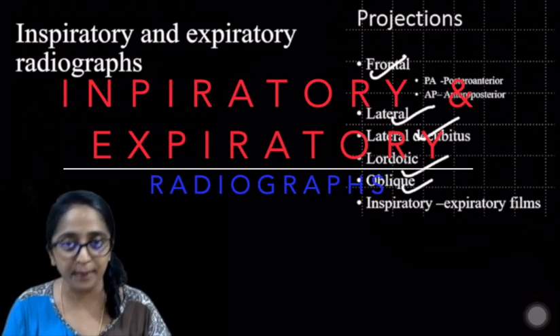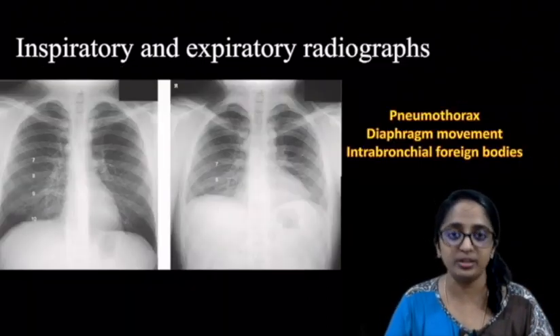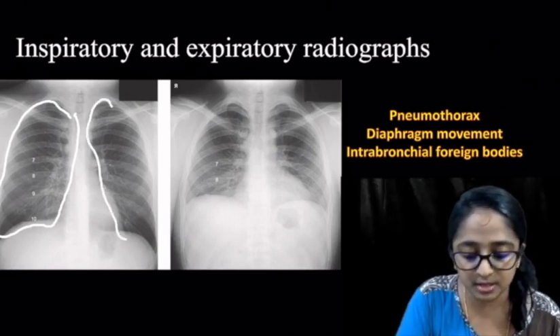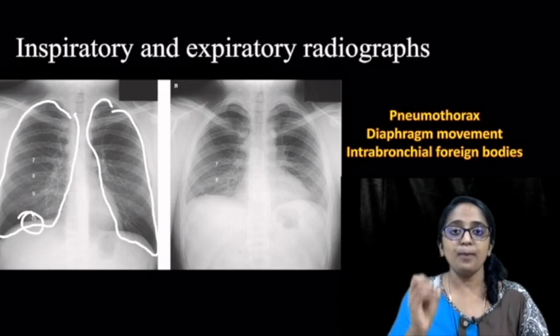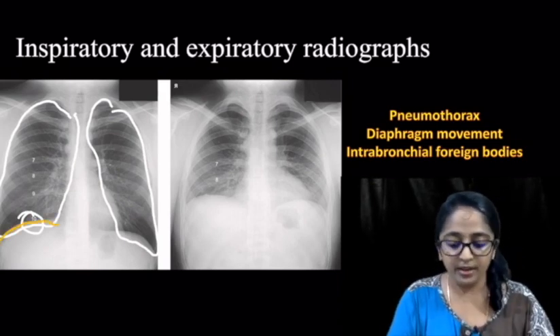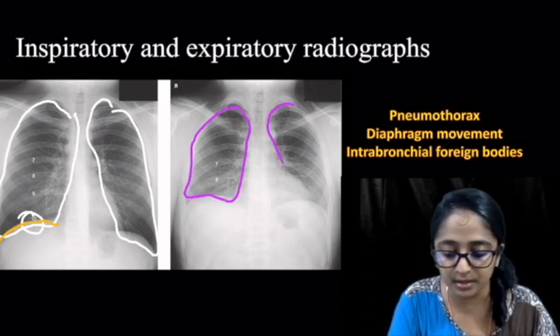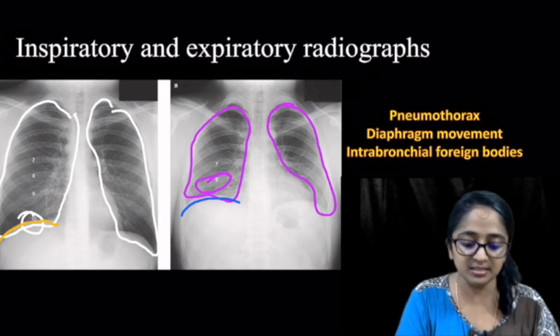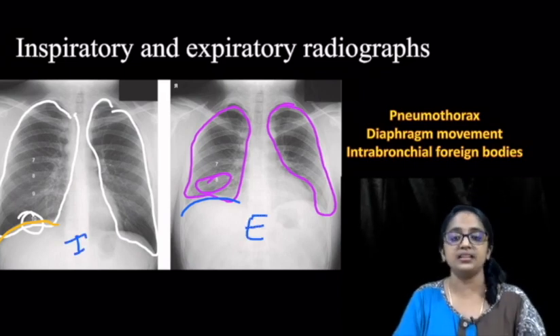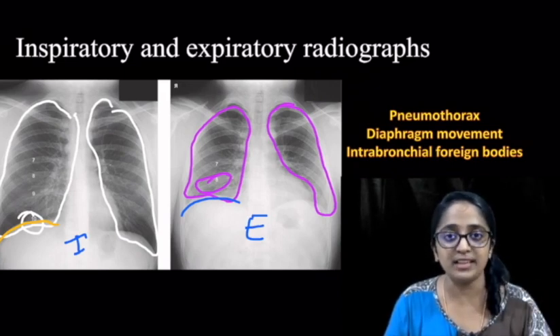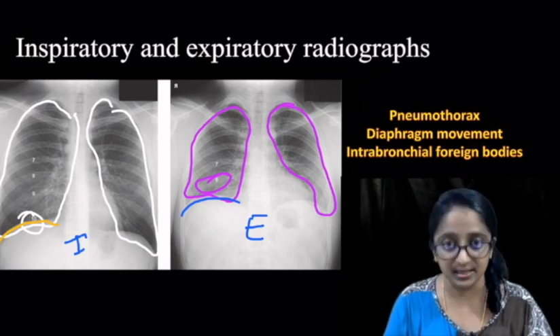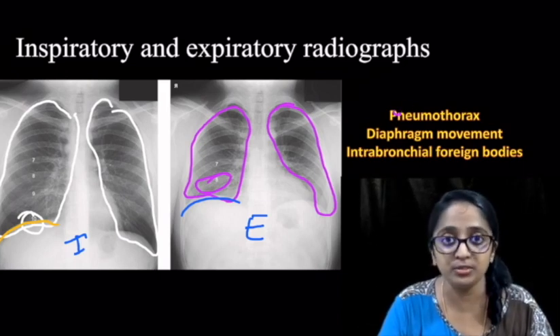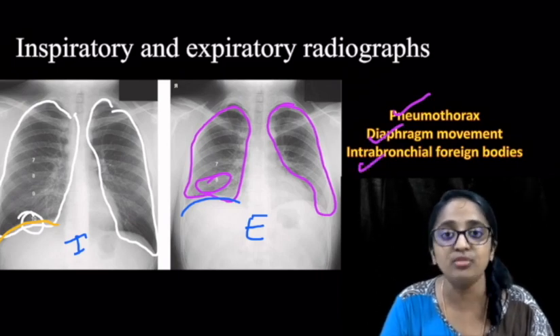Coming to the final topic: the paired inspiratory-expiratory radiographs. On the left you can see lung fields with relatively preserved volume — the tenth posterior rib cuts across the dome of the diaphragm. On the right, the lung volumes appear relatively smaller, with only the eighth rib cutting across the dome of the diaphragm. So this is the film taken in inspiration and this is the film taken in expiration. The standard rule is to go for chest frontal projection in adequate good inspiration, but we prefer additional expiratory views in three cases: in cases of pneumothorax, to assess diaphragmatic movement, and to detect intrabronchial foreign bodies.